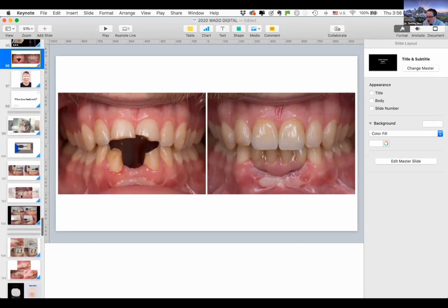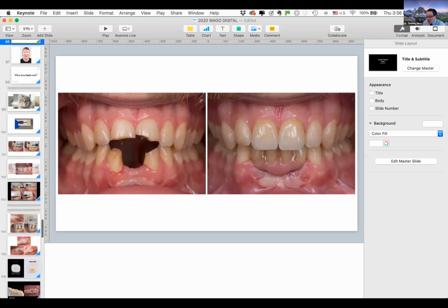What photos would you take to match a single canine crown, and from what angle? Do you send pictures of the contralateral? Sure, that's a great question. Because the canine is the tooth that turns the corner, I would take it from 2 different angles.